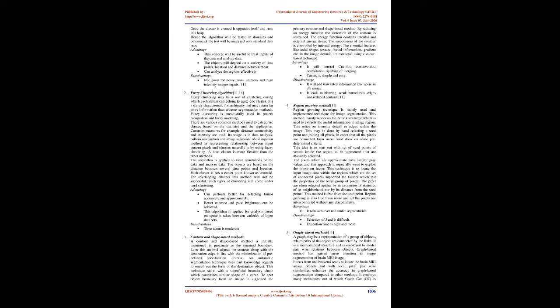It reduces the distance of each element to the center point of the cluster. Once the cluster is created, it upgrades itself and runs in a loop. Hence the algorithm will be tested in domains and the outcome of the test will be analyzed with standard data sets. Advantage. This concept will be useful to treat inputs of the data and analyze data. The objects will depend on a variety of data points, location, and distance between them. Can analyze the regions effectively. Disadvantage. Not good for noisy, non-uniform and high-intensity images.